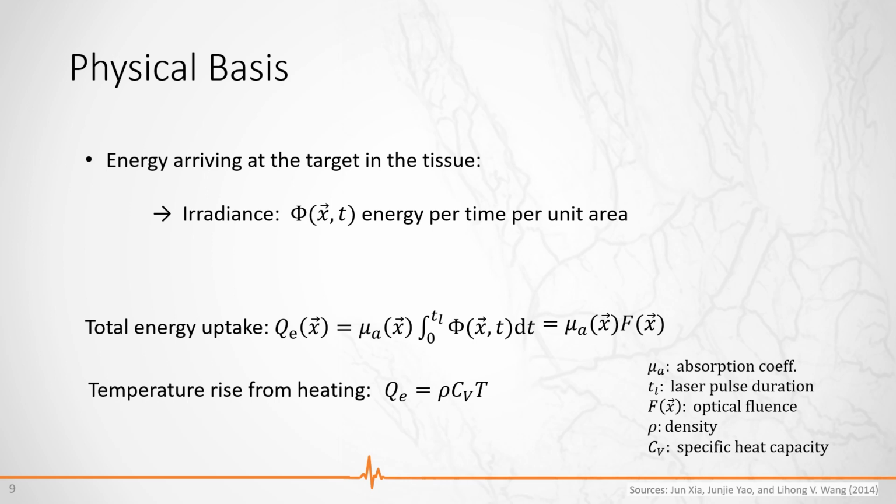The energy uptake corresponds to heating. We assume that we tuned our laser in such a way that only conversion to temperature rise takes place. So we do not have any other unwanted effects like chemical reactions or photodisruption, all the energy is translated to heat. Therefore, we can express the temperature rise through our laser pulse by this. This temperature increase is instantly translated to a pressure wave.